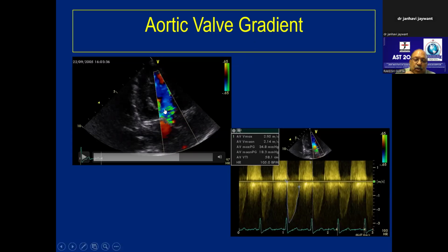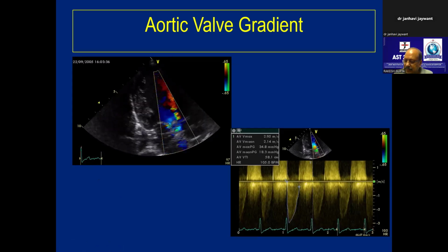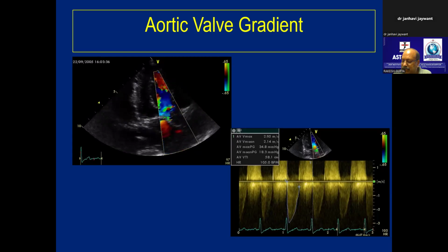Correct? Pulse wave over here and continuous wave Doppler across it. Pulse wave will give me the LVOT VTI and continuous wave will give me the aortic valve VTI. Just remember this. Sir, is there any specific distance in the aorta we have to look for the aortic valve VTI? Below the aortic valve is LVOT. Through the aorta is the aortic valve VTI. Any point in the aorta, just cross distal to the leaflets.